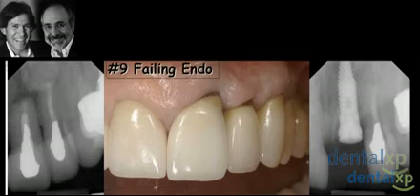So when we go ahead and take a look at a failing tooth and we're going to replace it, we don't just think about placing an implant. We really start thinking about the soft tissue as a curtain for the final aesthetic result. And obviously for a single tooth central incisor case, we really have to consider that from the onset. Where is the bone in this area, the interdental area, the separation of the implant from the lateral incisor, and then of course the soft tissue on the labial aspect, even to begin with, is already a concern for us.